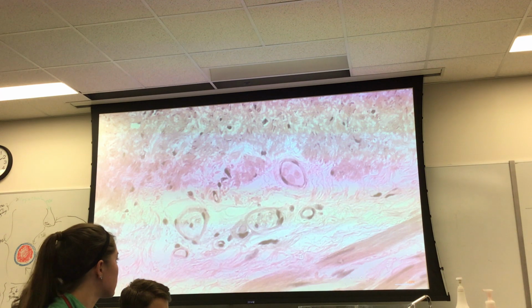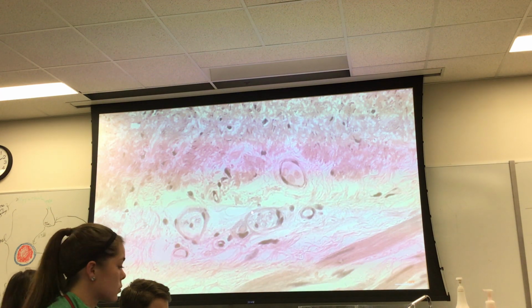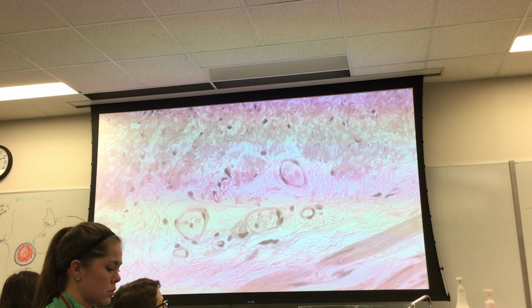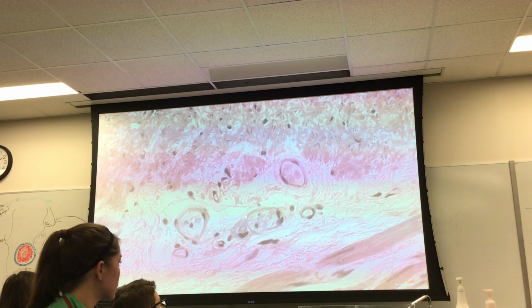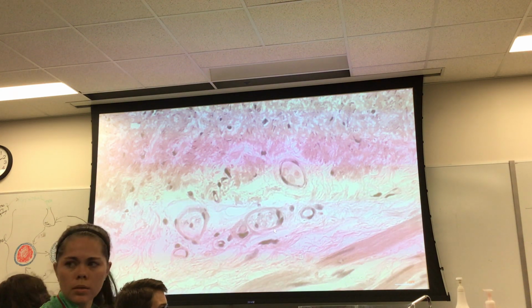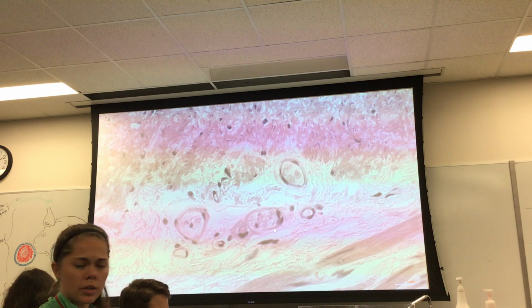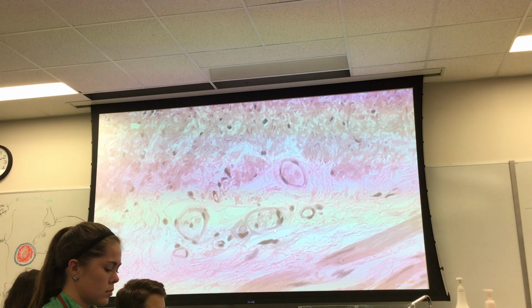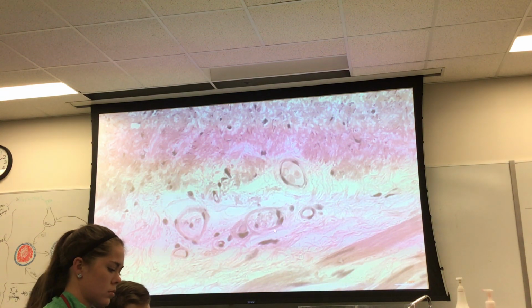What is this structure that surrounds this group of myelinated axons, forming a structure we could call a fascicle? What is this thing? Perineurium. Yeah, right. Okay, so I want you to picture this. Picture a big nerve that's got an epineurium, perineurium, and a bunch of individual fascicles.